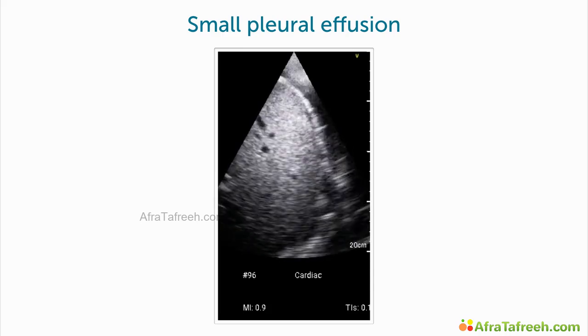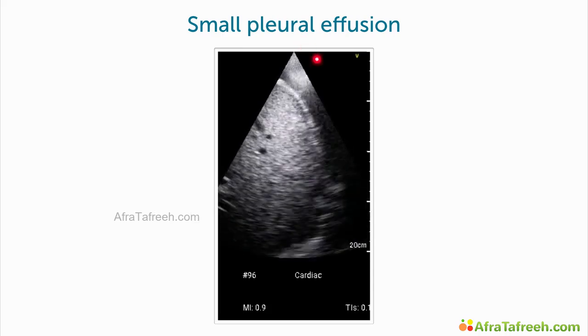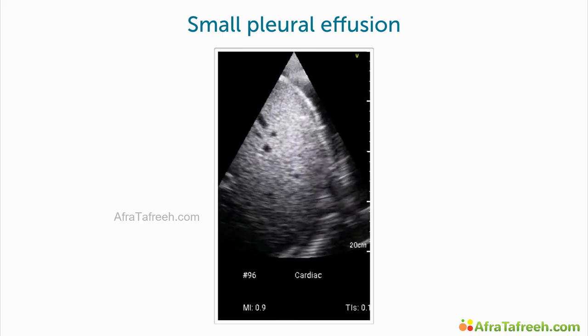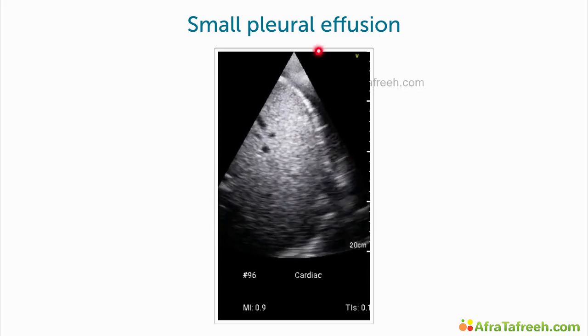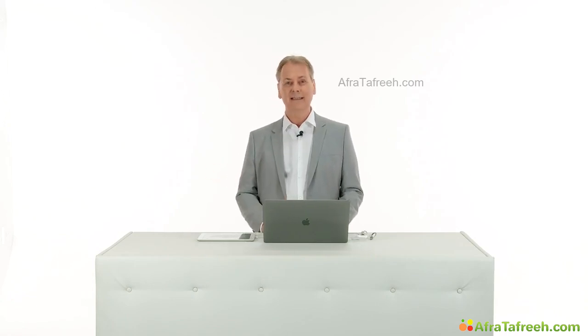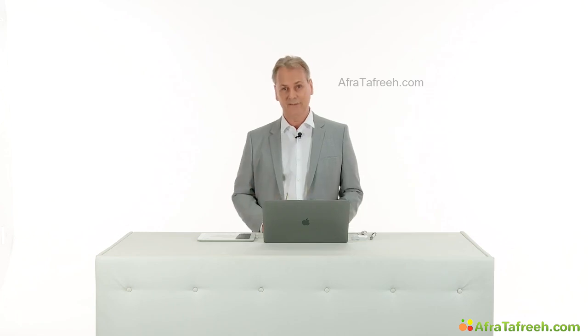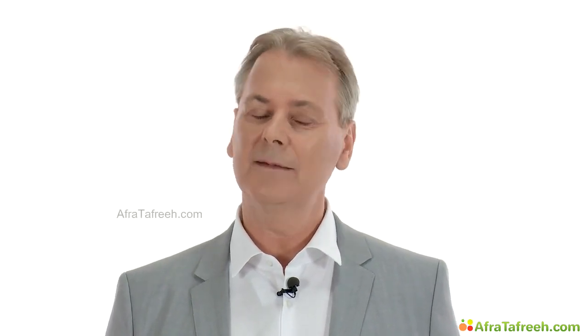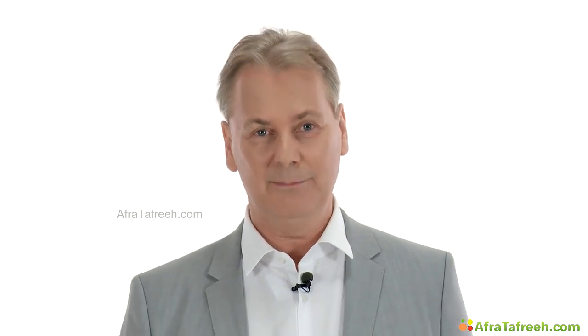Now, we'll turn to the lung ultrasound. What we see here is a small pleural effusion. This is not a large effusion as we saw in some of the previous examples, but we can detect it with ultrasound. Now, in the light of the findings that we have with echocardiography, we know that this is most likely associated with heart failure. This patient has dilated cardiomyopathy. As a matter of fact, a very severe form. What do we learn? We can use both lung and heart ultrasound together to establish diagnosis and to pick up findings which are otherwise sometimes not so easy to see, at least not in a primary care setting.